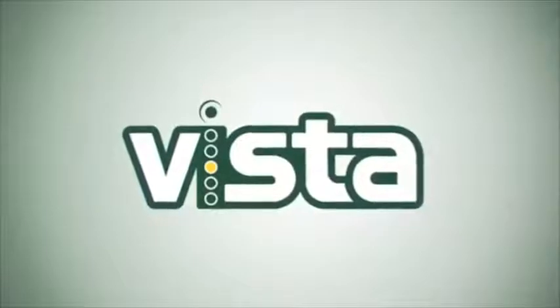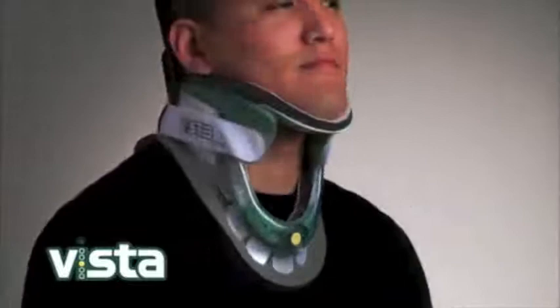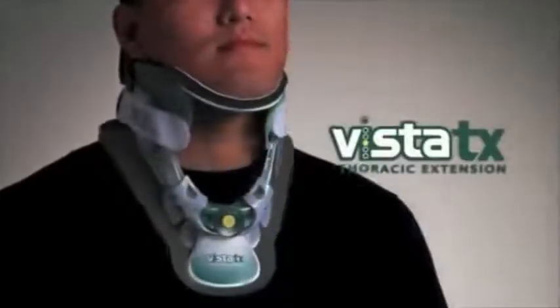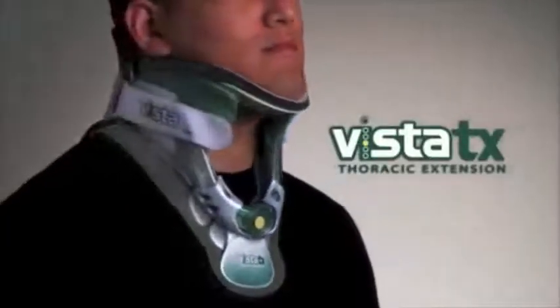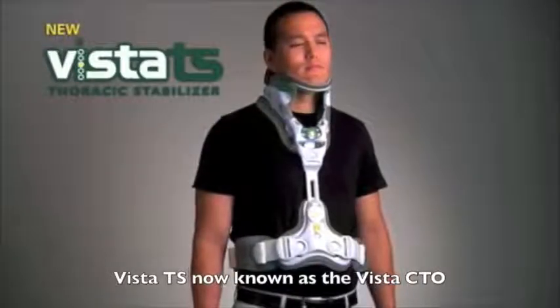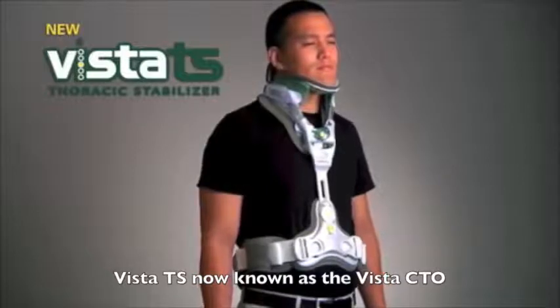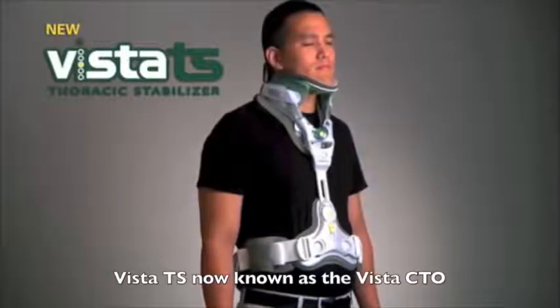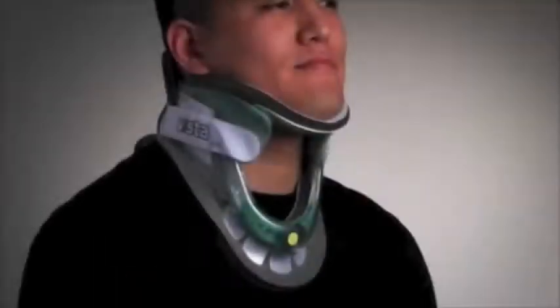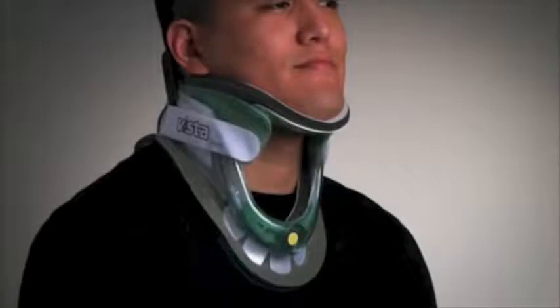The Vista line by Aspen Medical Products includes the Vista Collar, the Vista Thoracic Extension, and the Vista Thoracic Stabilizer. Only one size is needed. The Vista line is fully adjustable to fit the vast majority of patient anatomies, providing safe and effective motion restriction for all patients in need of an extended wear product.